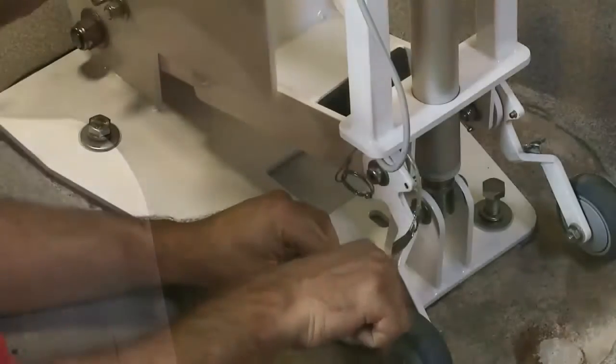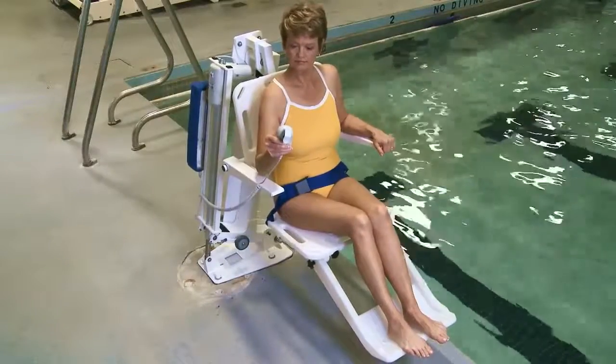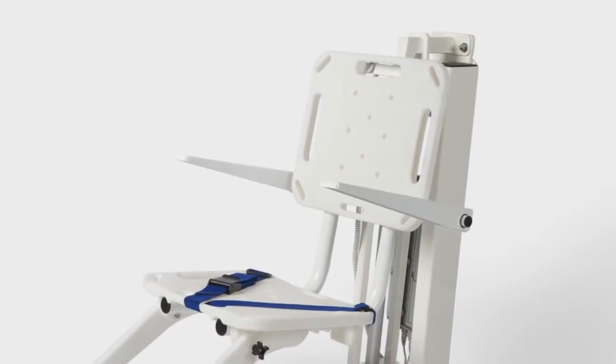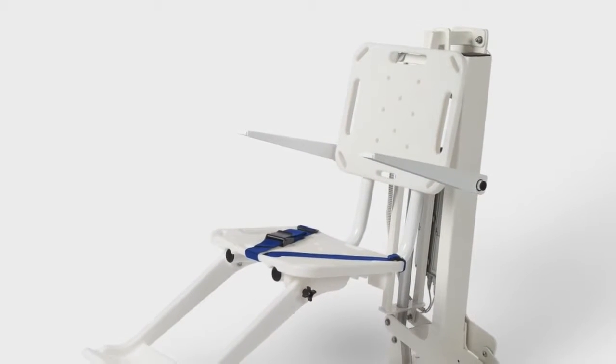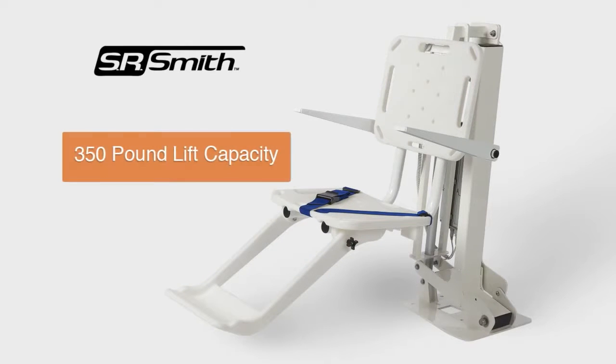In this video, we are going to demonstrate how to properly install, operate, and maintain a multi-lift, one of several independently tested and verified ADA compliant pool lifts from the swimming pool accessibility experts at SR Smith. The multi-lift features a 350-pound lift capacity.